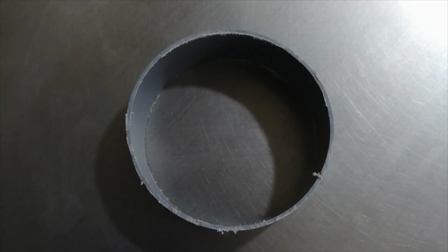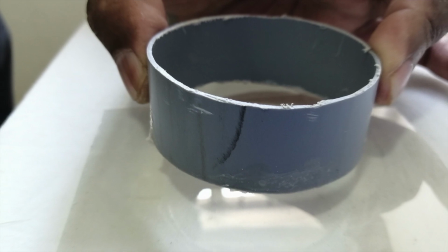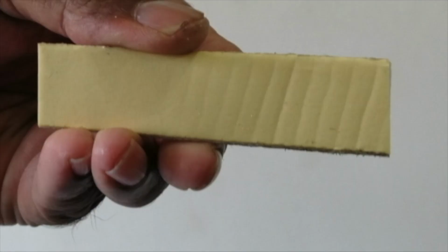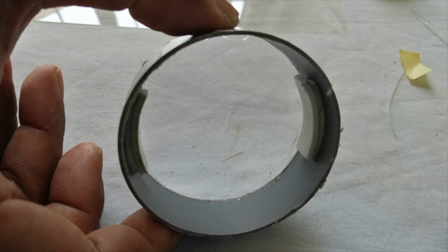Take a PVC pipe of 2-inch diameter and cut it as shown in the figure with a thickness of approximately 1 inch. Take a transparent plastic sheet of adequate length, put a strong adhesive on the edges of the cut PVC pipe and keep it over the plastic sheet. Cut the sheet surrounding the pipe. Now take a double-sided adhesive tape and cut it into 4 small pieces. Stick the 4 pieces on the inner side of the pipe, one over the other as shown in the image.